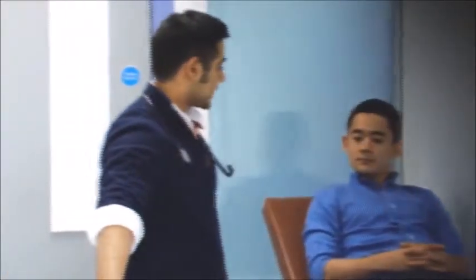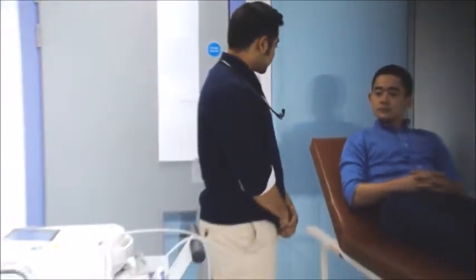My name is Corin Rajan. I'm a fourth year medical student. The doctors have just asked me to quickly take a look at your heart and see how it's working. I'm going to be using this ECG machine to do that. Have you ever had one of these procedures done before?